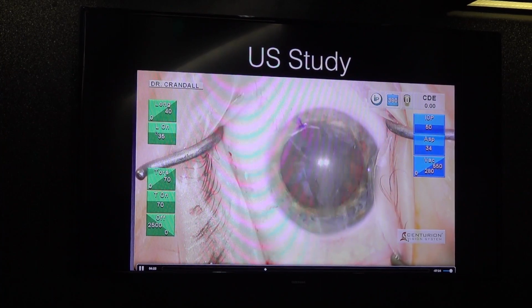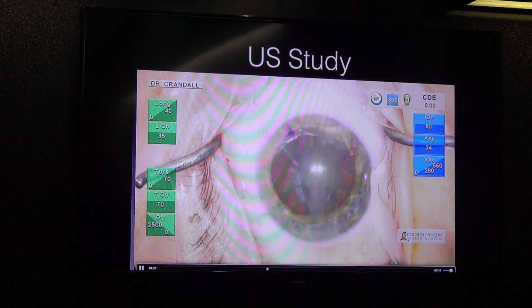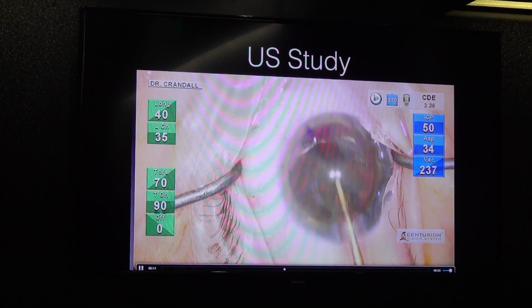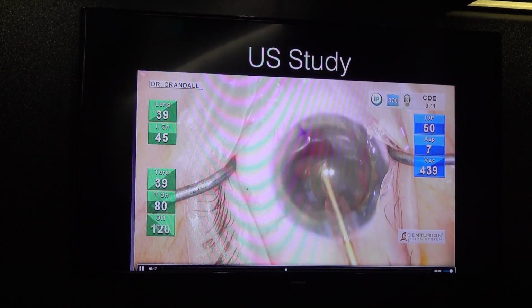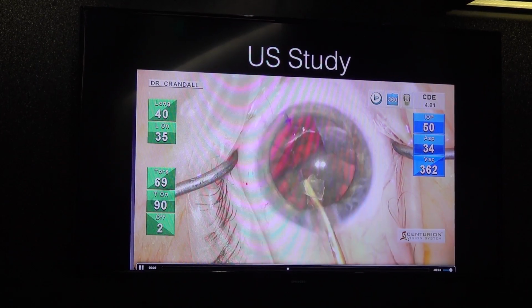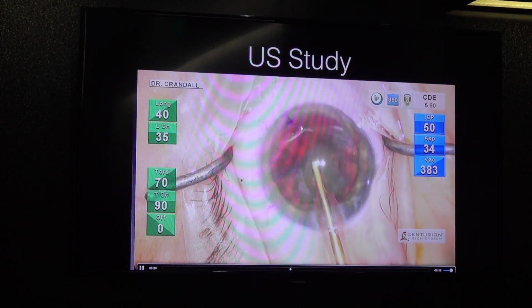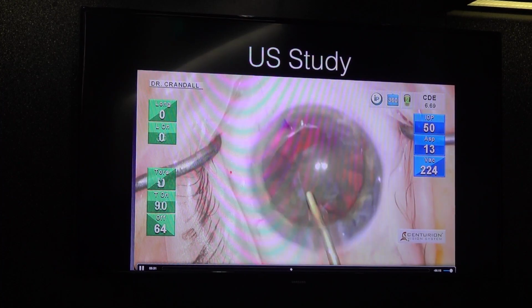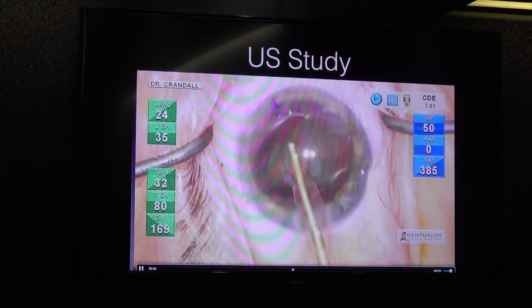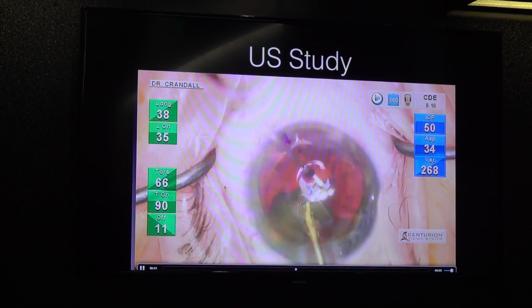And it turns out that this is probably too short of a time right here for different kinds of cases. So we've got a long ways to go to really see what's usable. And because this was a resident case, we used the standard tip rather than my new favorite, the new Akahoshi tip. So, changing parameter times and all that, because we want them to understand the physics of what they're really doing. So we've got the study's beginning.